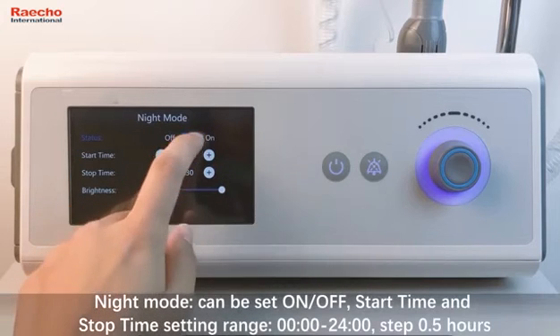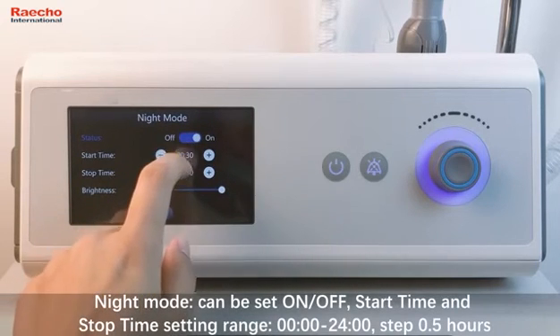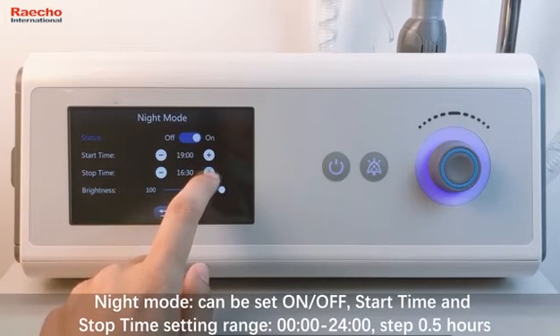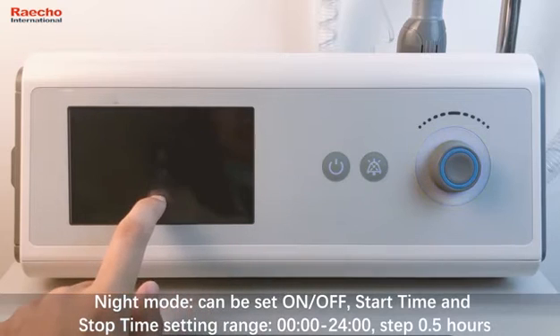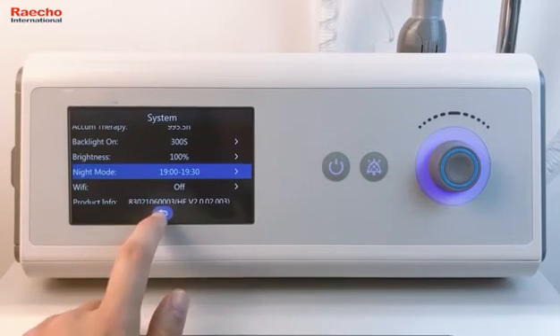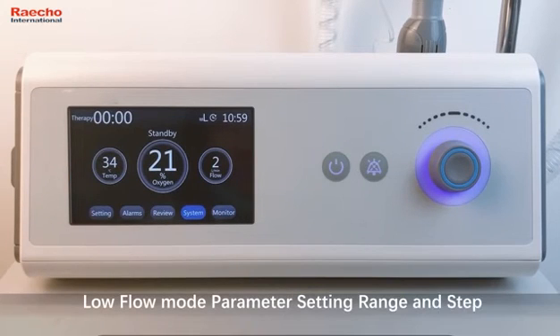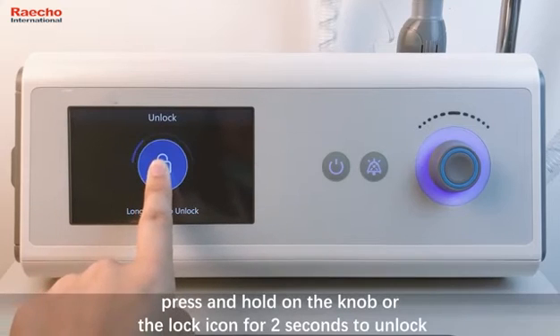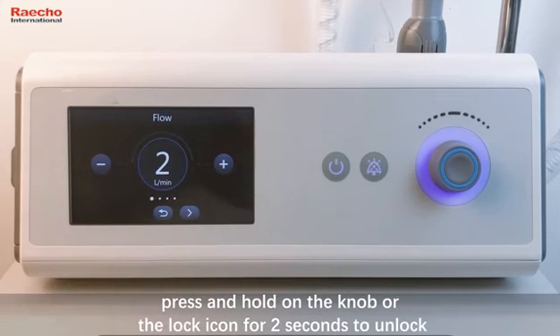Night mode can be set on, off. Start time and stop time setting range 0 o'clock to 24 o'clock. Step 0.5 hours. Low flow mode parameter setting range and step. Parameter setting. Click setting. Press and hold on the knob or the lock icon for 2 seconds to unlock.